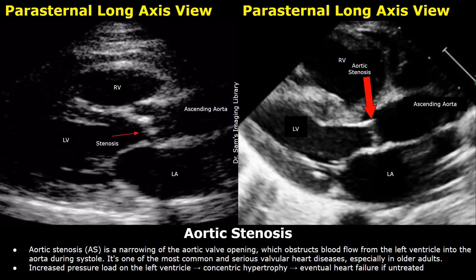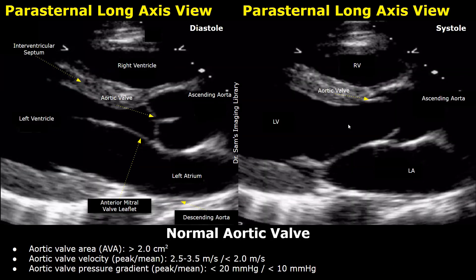In echocardiography, this is the aortic valve in the parasternal long axis view. You may find hyperechoic calcifications on the aortic valve leaflets. These images show the normal aortic valve in the parasternal long axis view. The image on the left is taken during diastole when the heart relaxes — the aortic valve is seen closed. The image on the right is taken during systole and the aortic valve is opened.